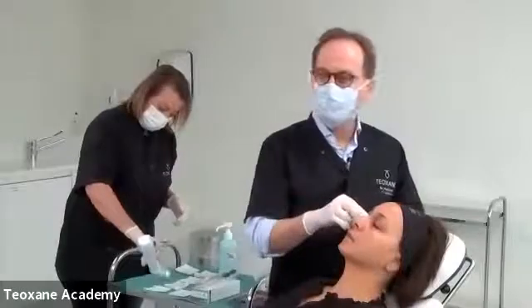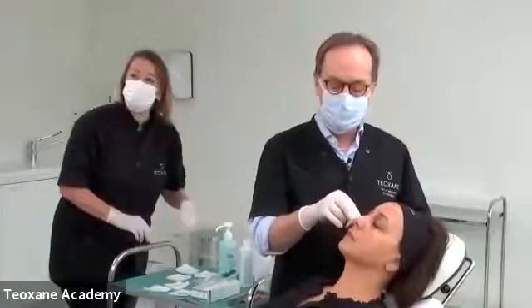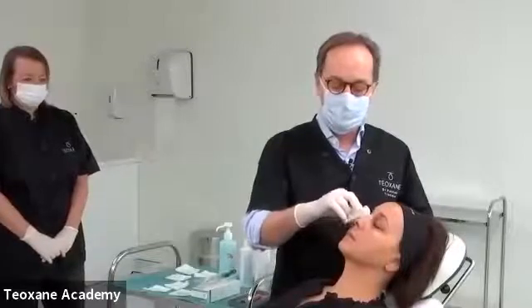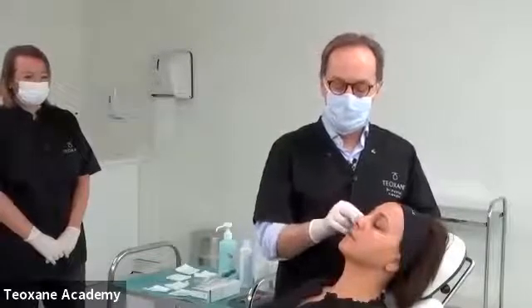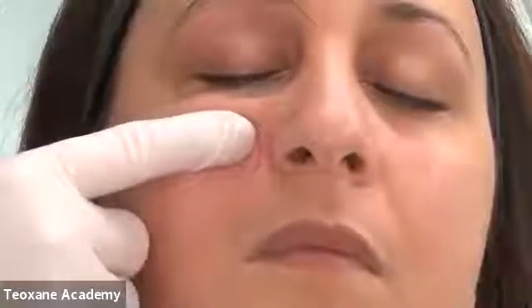Why do I do that in a sitting position? Because if you do your injection in a lying position, your patient will have this fat here. If we can zoom on the patient and not on me. If you are looking here, the fat, when she is lying, covers the depression. So if I do my injection and I am a little bit anxious, I will put my cannula superficially, and my product will not be in the tear trough location, but in the superficial fat.